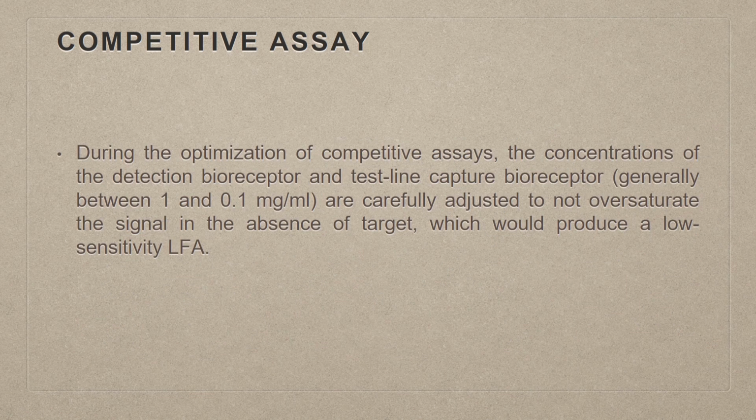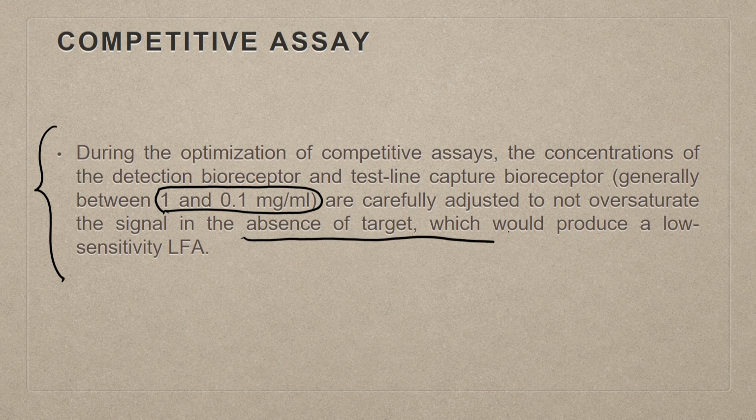Now, during the optimization of competitive assays, the concentrations of the detection bioreceptor and the test line capture bioreceptor, generally between 1 to 0.1 milligram per ml, are carefully adjusted so as not to oversaturate the signal in the absence of target, which would provide a low sensitivity LFA.